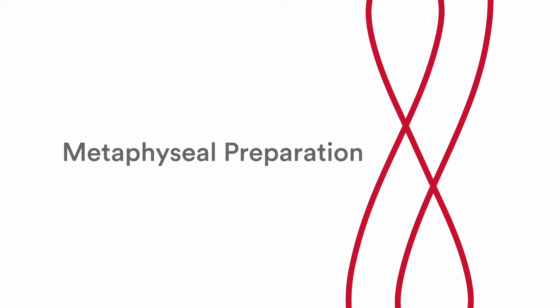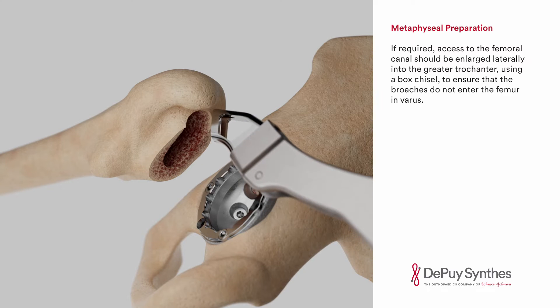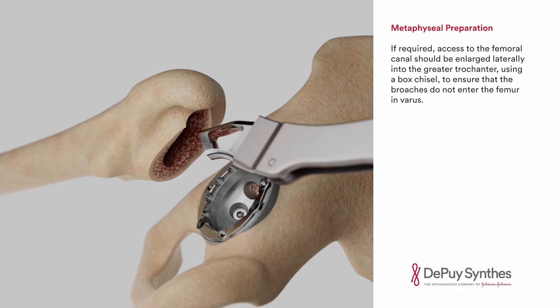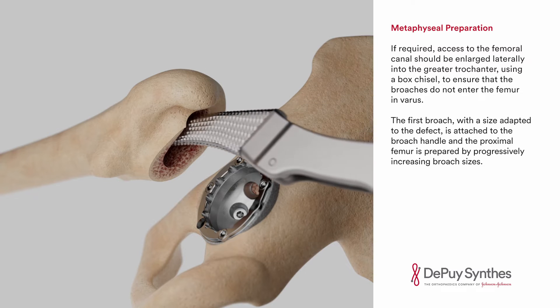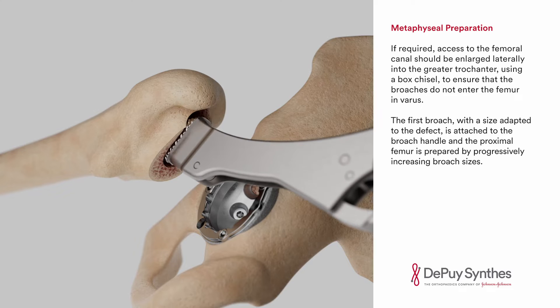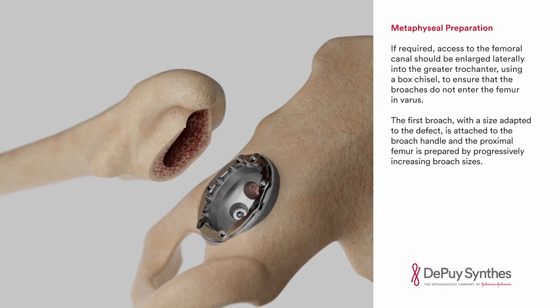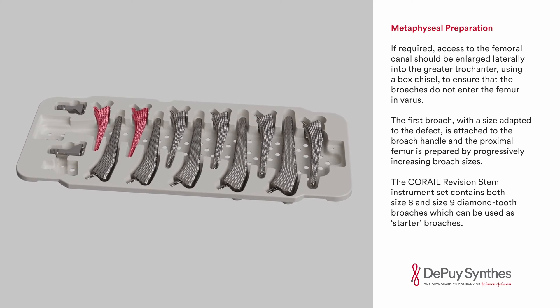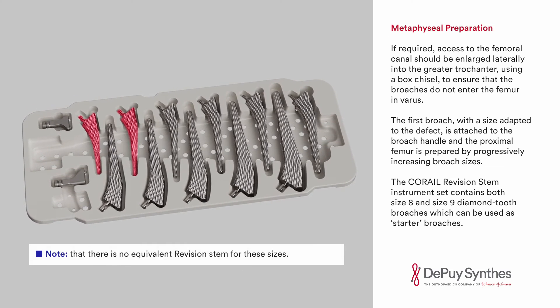Metaphyseal preparation. If required, access to the femoral canal should be enlarged laterally into the greater trochanter using a box chisel to ensure that the broaches do not enter the femur in varus. The first broach, with a size adapted to the defect, is attached to the broach handle and the proximal femur is prepared by progressively increasing broach sizes. The CORAIL Revision Stem instrument set contains both size 8 and size 9 diamond tooth broaches, which can be used as starter broaches.